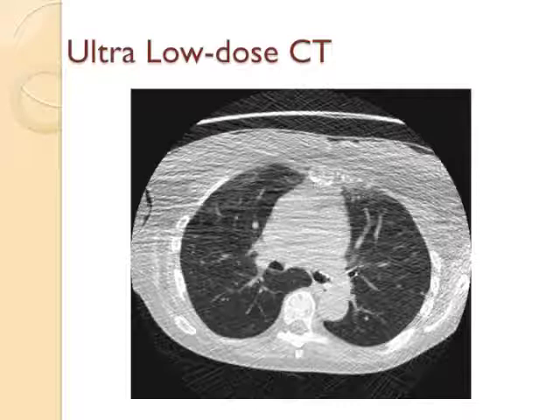This is one image of an entire CT scan of the entire chest, several hundred of these images make up the chest, and the total dose here is probably about 2 chest x-rays. So it's well under half the dose of a mammogram. And these dose reduction techniques are continuing and will continue to get better. And you can see here on the box, I'm just showing you that you can still clearly see this small nodule, which measures about 2 or 3 millimeters.